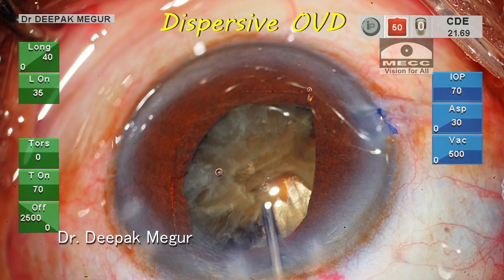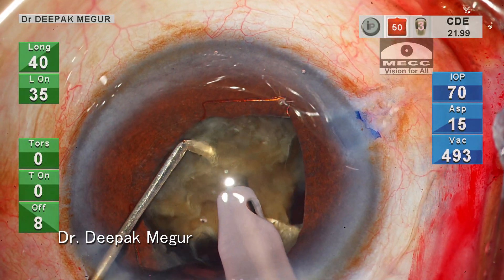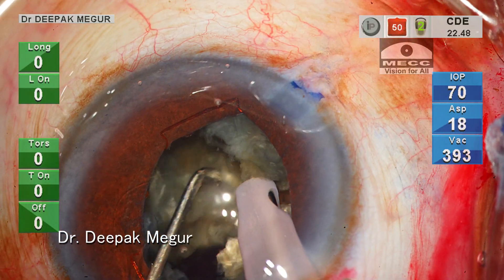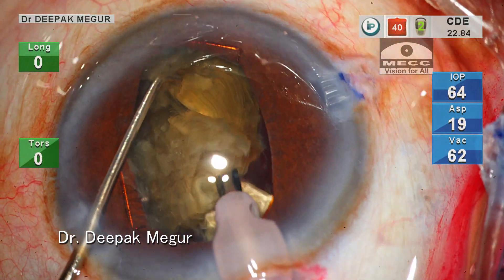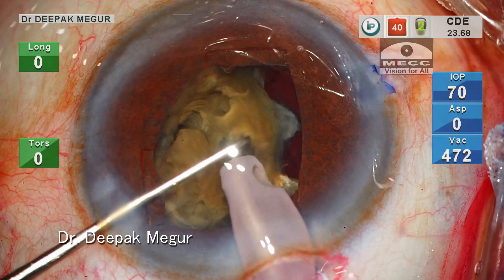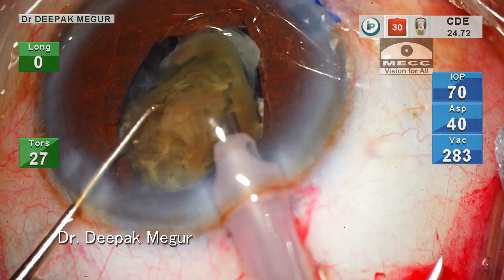I am refilling the anterior chamber with dispersive OVD first, followed by HPMC underneath it. The last big fragment needs to be divided first, but since the bag is empty, lateral separation is slightly difficult and not very effective. So I just flipped the two pieces upside down and phacoed the part which is holding them together. That was easy.